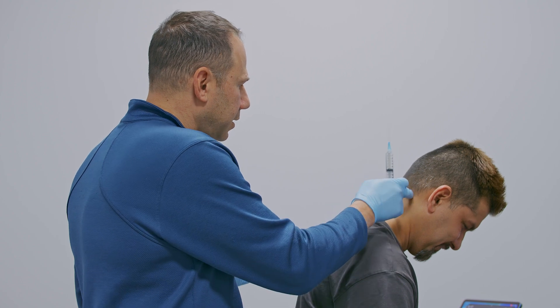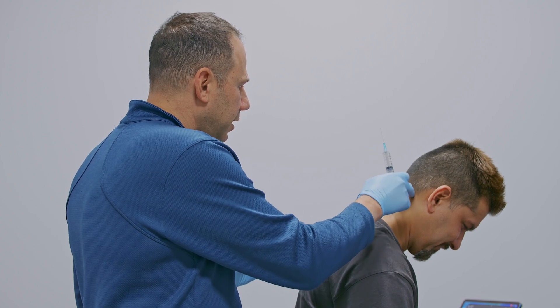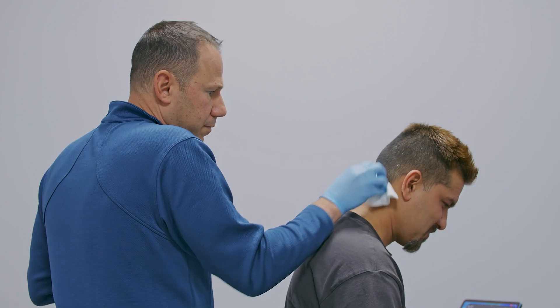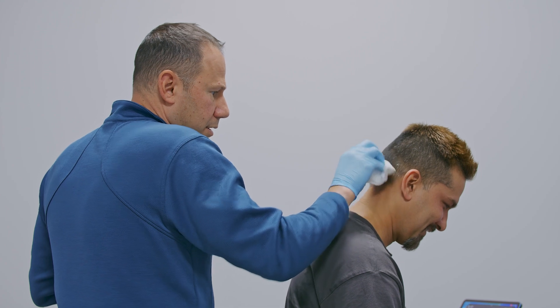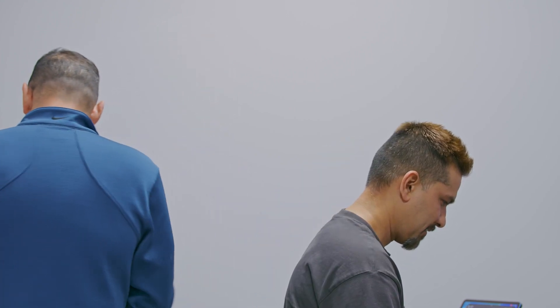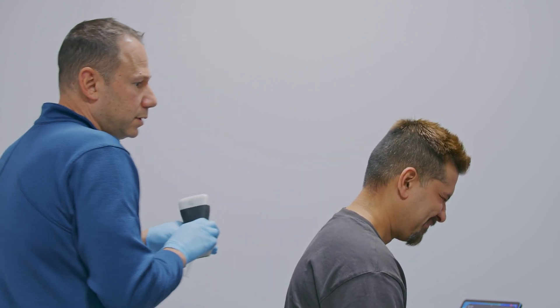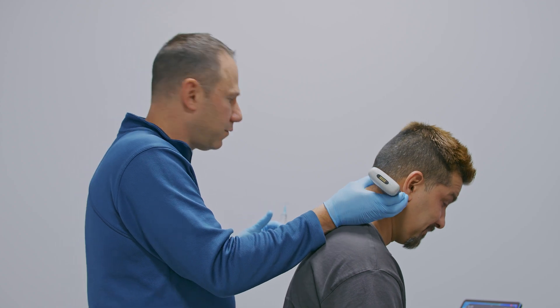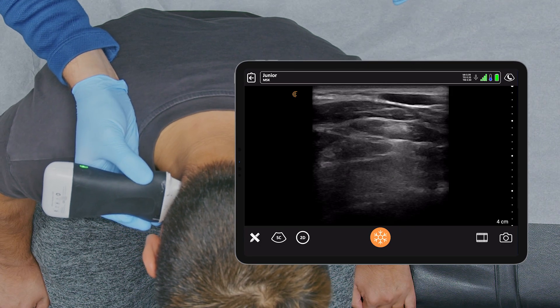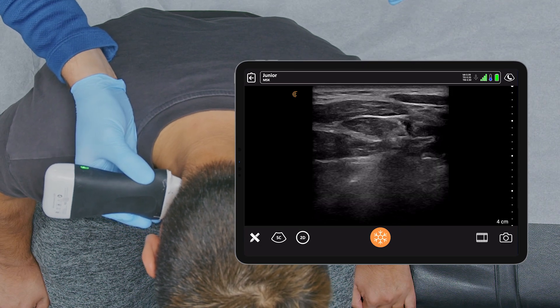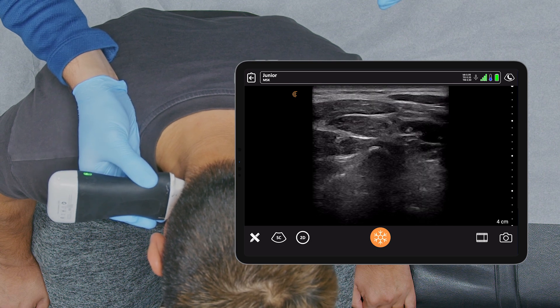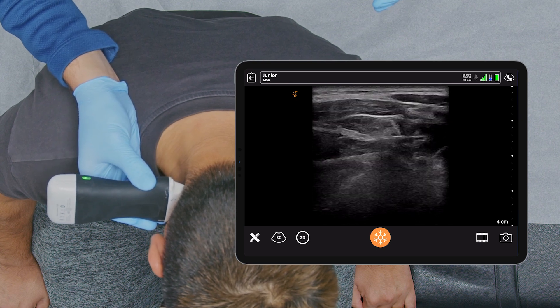You have some pain in this region normally? Yes. In the event that other muscles are involved, I'm going to do some trigger points as well as some paravertebral injection to try to get the medial branch nerve at this level and denervate any of the tissue.